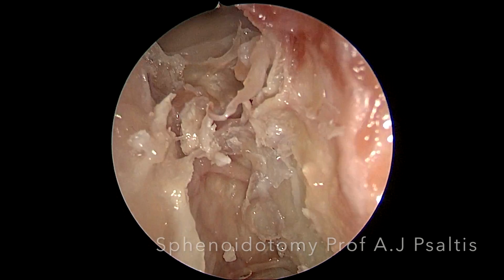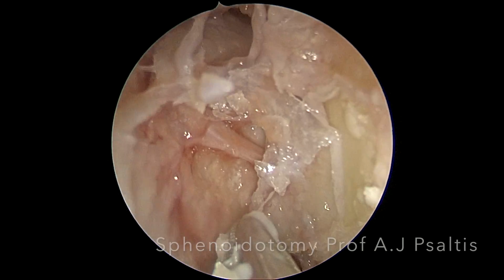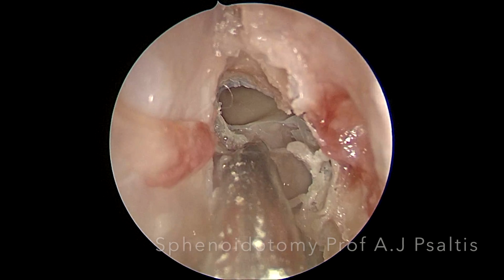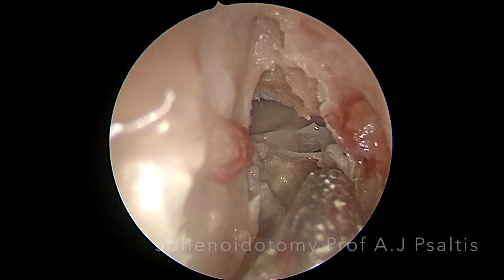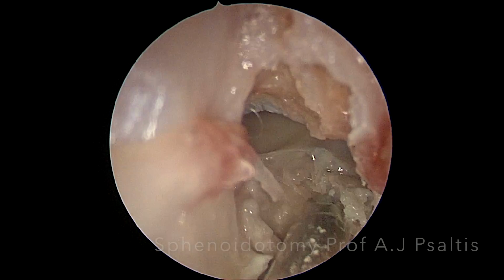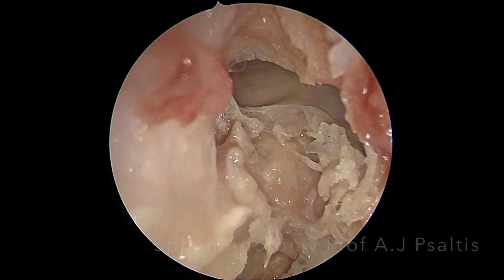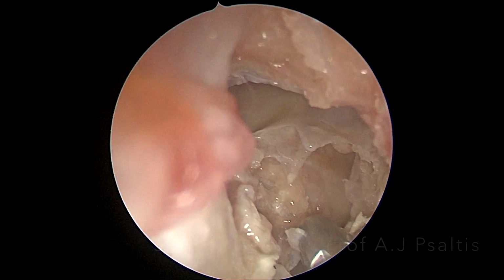As these frontal recess partitions can narrow the frontal recess, here we can visualize the anterior ethmoid artery as it courses along the skull base in a postero to anteromedial direction. A microdebrider can then be used to remove the remaining soft tissue and maximize the opening of the frontal sinus proper. Here we can visualize the entire skull base from the frontal sinus right back to the sphenoid sinus.